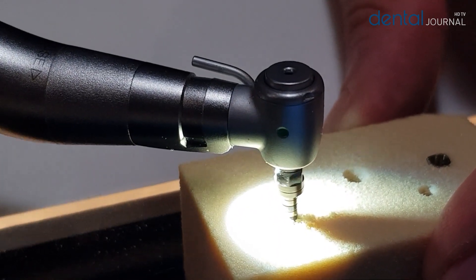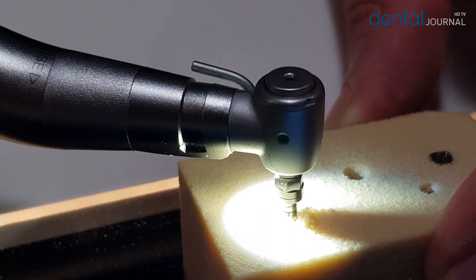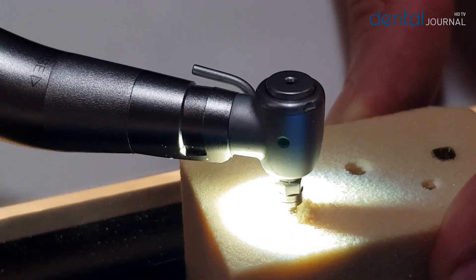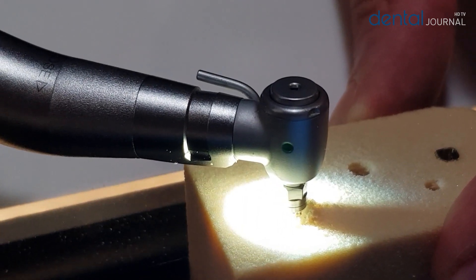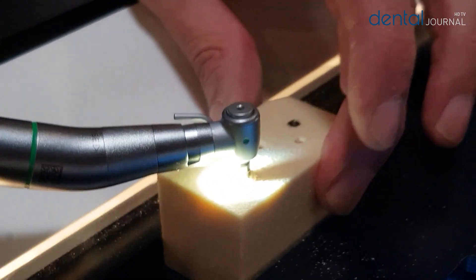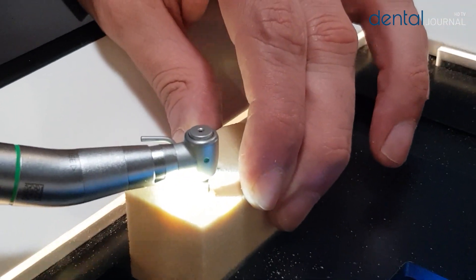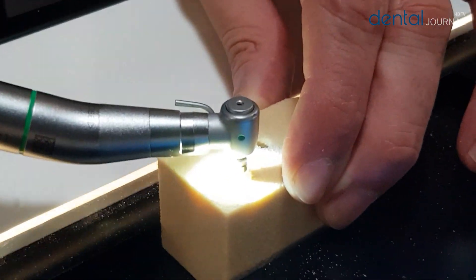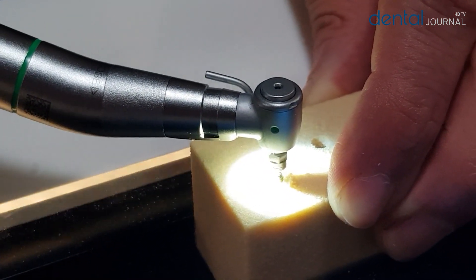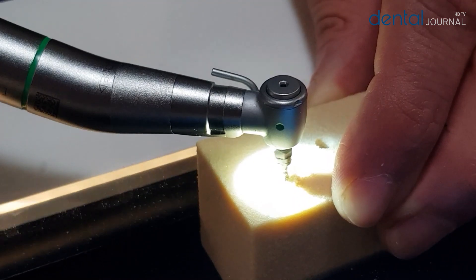It sits very slowly and runs into the bone. At the end you can take it out by the reverse mode, so it leaves all the bone chips in the hole.